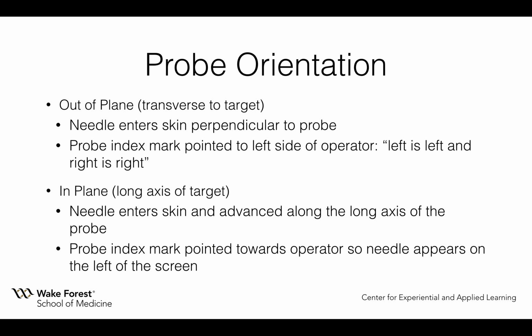For the in-plane view, typically we would keep the index mark on the probe, the mark that lets us know which side of the probe is which, towards the operator. There are some procedures and some specialties where they reverse that and prefer to keep the index mark away from the operator so that the needle enters the image from the other side of the image. And so if there's a difference, we'll make sure we note that as we go through our procedure modules.